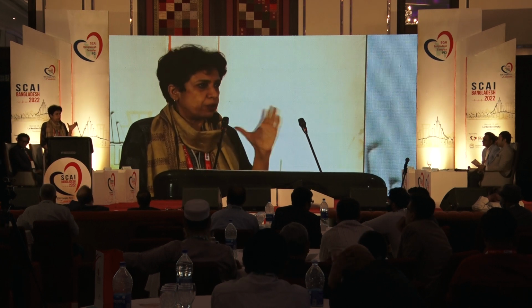Professor Fazlur Rahman, sir, your comment, please. Deep calcification. Well, actually, the superficial calcium will prevent your stent from expanding. The deep calcium usually will not do that. So if you have a lot of superficial calcium, that will prevent the stent from expanding. Thank you.